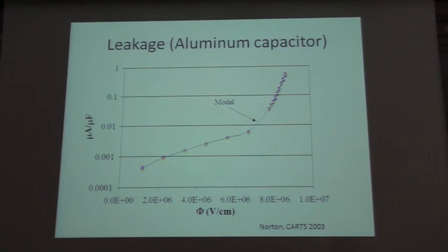Now, if you were designing a device for thousands, hundreds of thousands of uses, you would want to derate this quite a bit. If you operate up in this range, ion motion is happening in your dielectric. Your system is not really quite stable. It's changing over time. So most people operate at 50% derating or more. And this is a case where our application makes things easier for us. Since the device spends certainly no more than 5 minutes at voltage, the battery wouldn't last if it did more than that. And most people only need a couple therapies over the life of the device. So the battery is really only capable of delivering 150. So we can operate at a pretty high voltage and not be affected by ionic motion changes over the life of the device. That really allows us to increase the energy density quite a bit just by pushing that voltage up.